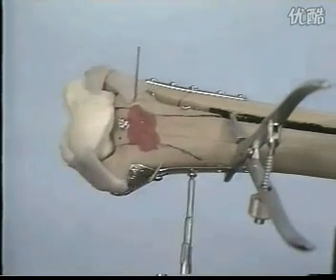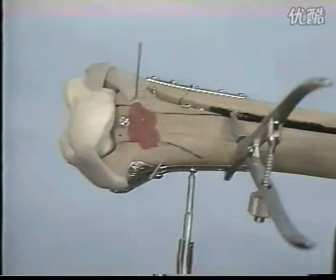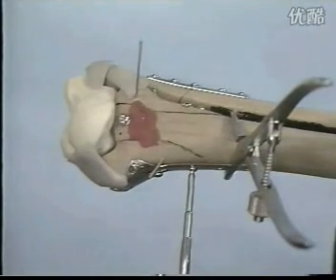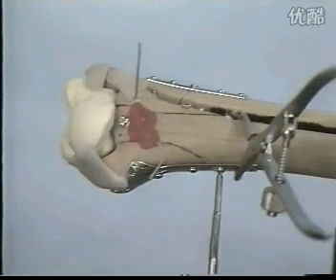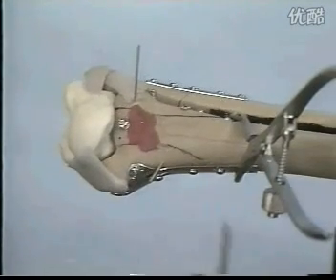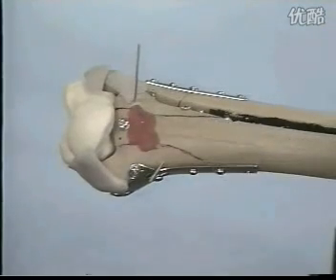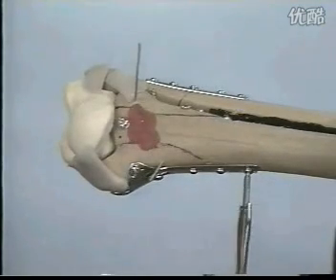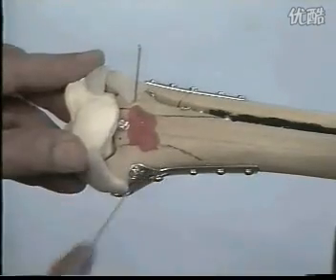In the proximal shaft area, however, cortical screws are inserted. Now we remove the Kirschner wires.